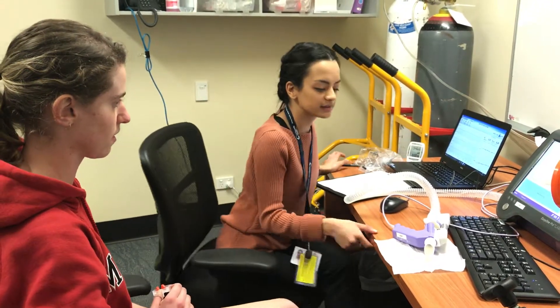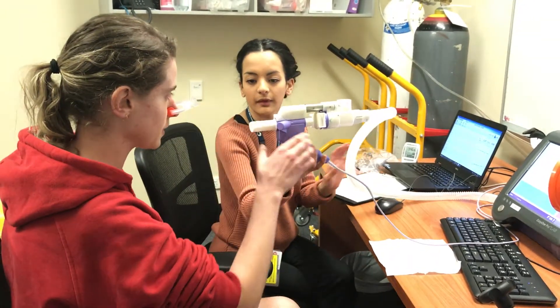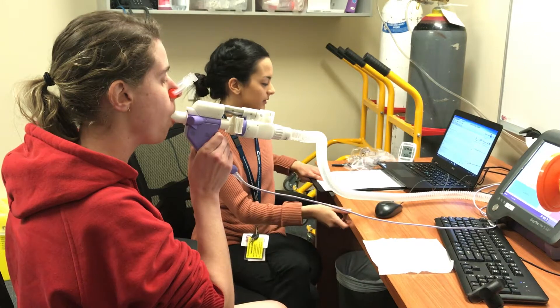Lovely. So we'll get you starting. Pop that nose peg on for me. Nice tight seal around the mouthpiece. Tongue under the mouthpiece there. Beautiful. Just some nice normal breaths for me, nice and relaxed to start with.